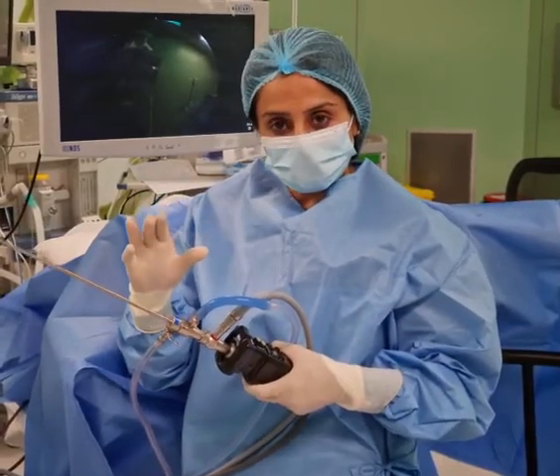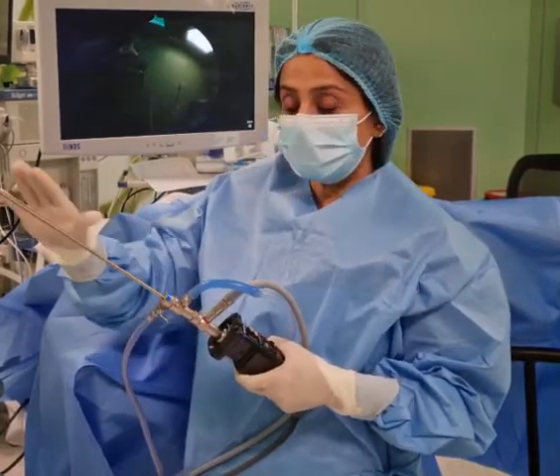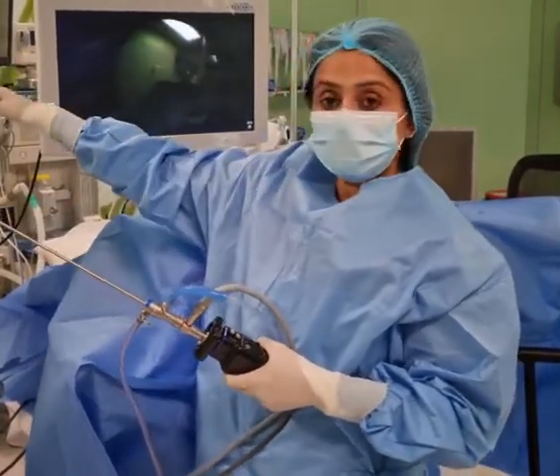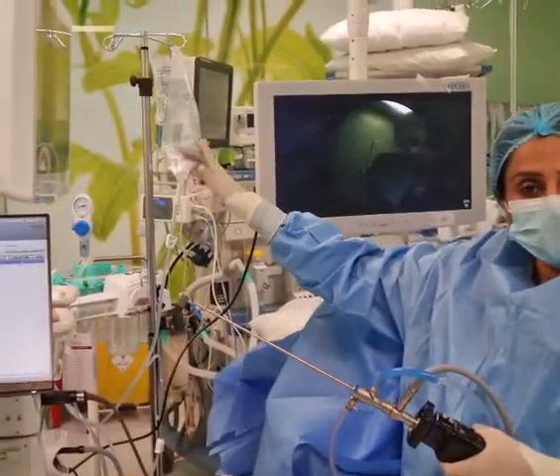We usually use normal saline to distend the cavity and to have a look inside the uterus. Whatever we see inside the uterus is then relayed on the TV monitor.